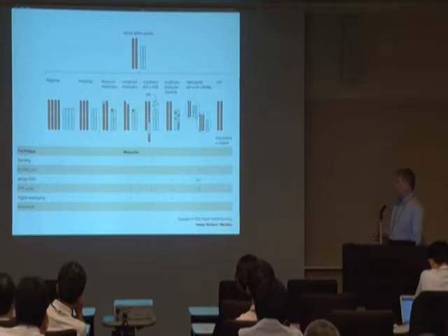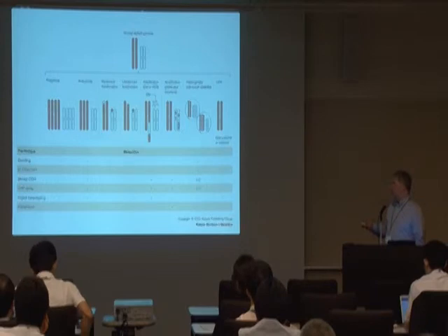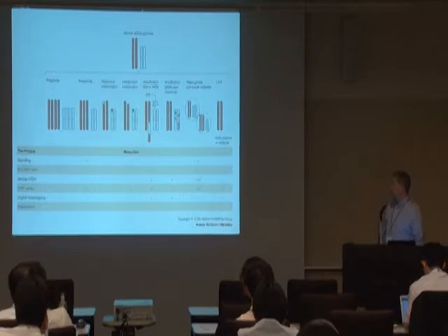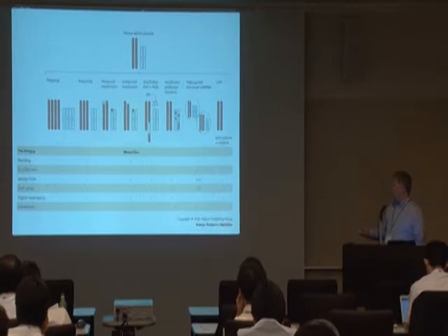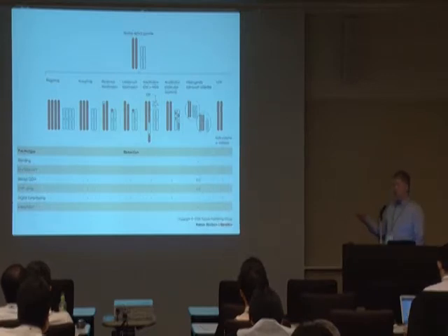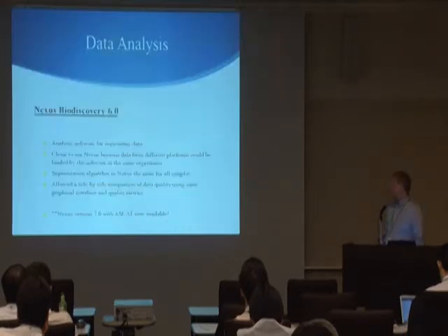And of course, it's important to remember that as a tool, a microarray is a part of a toolbox, as I said before, that has a lot of advantages and some limitations. And so these are the different types of genomic alterations that you can find in a sample. And the microarray is actually quite good at detecting a lot of these, but has some limitations in terms of, for example, detecting balanced reciprocal translocations, and in terms of interrogating, well, if you're not using a SNP array, of course, it becomes very difficult to sort things out like loss of heterozygosity. And so again, it's important to look at the kinds of testing that you want to do in the clinic and decide what the appropriate tool is for that.